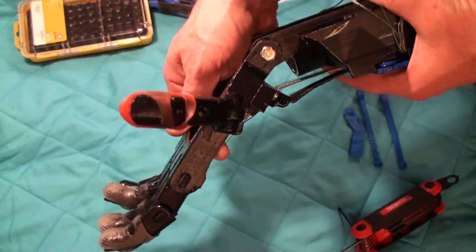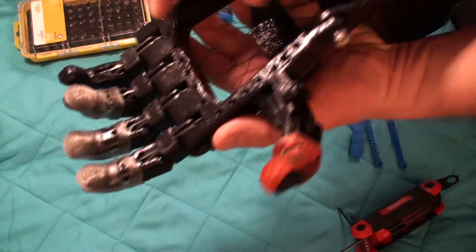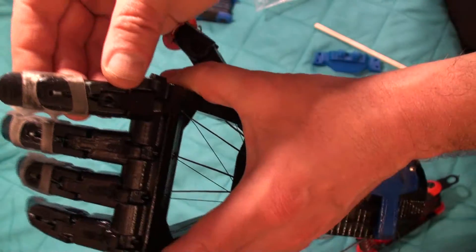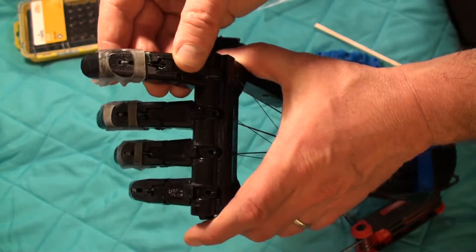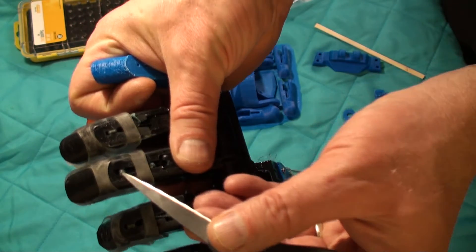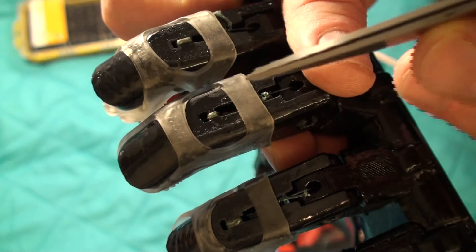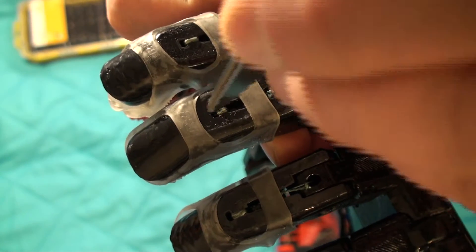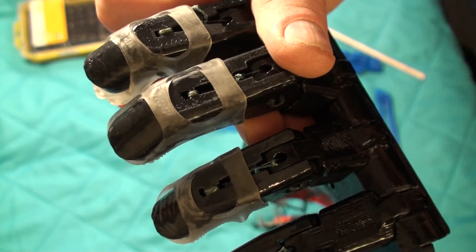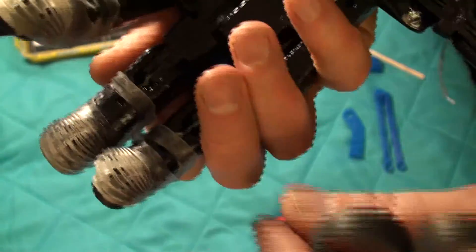The flexors are the strings that close the hand. The flexors start here, and what you'll do to thread them — the cable's tied around right here. You're going to push the cable through both holes, this hole here and this hole here, and push them down a channel so that both ends actually come out on the other side.